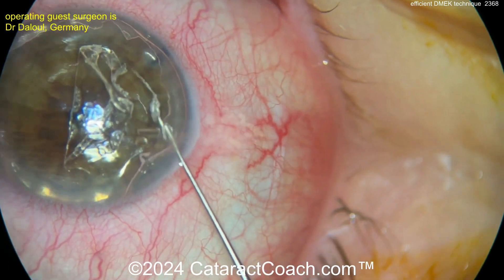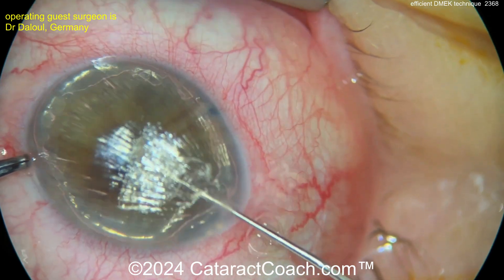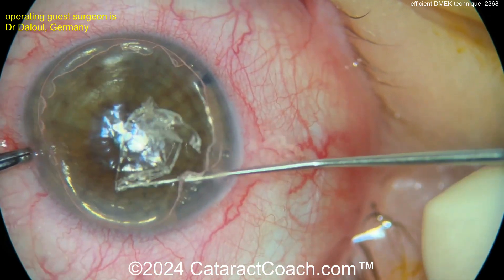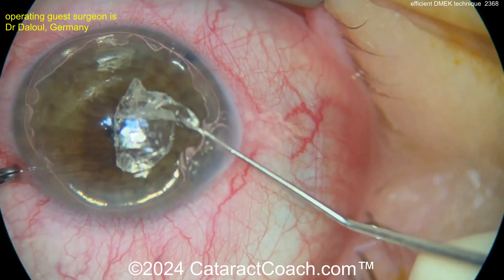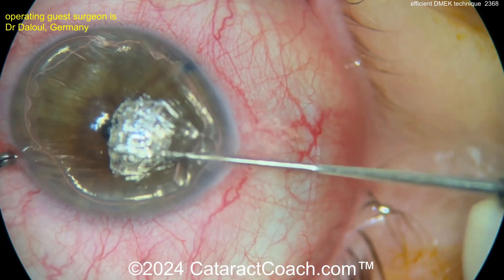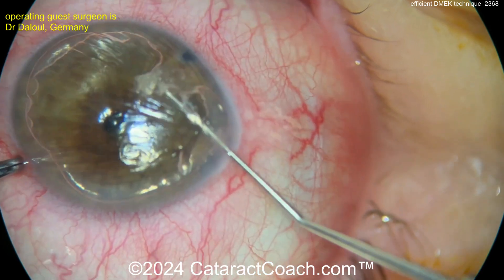If you need to refill the air bubble — because that air bubble is what aids you in visualization — sometimes we'll put the air bubble in and then put a tiny plug of dispersive viscoelastic right at the paracentesis, just a small plug to help keep the air in the eye so it doesn't come out. Surgeons have done a really efficient and beautifully done job with this.